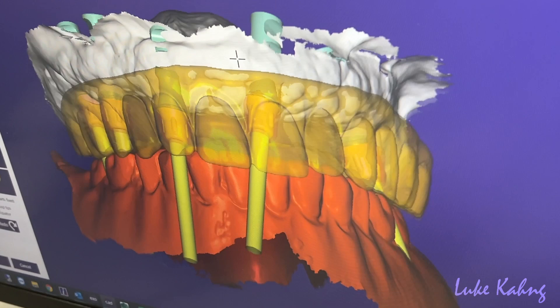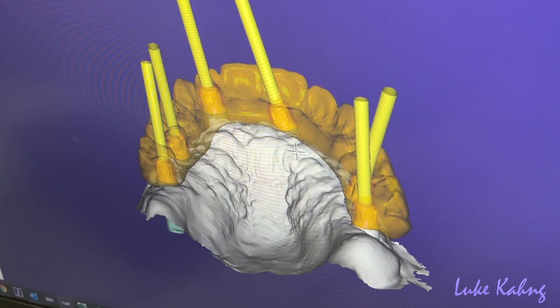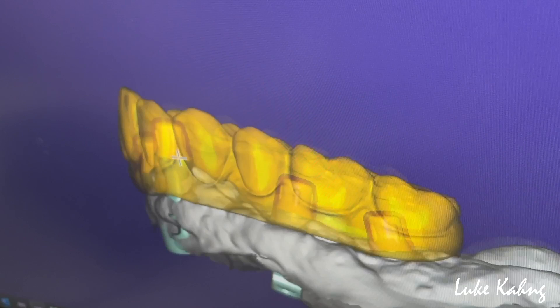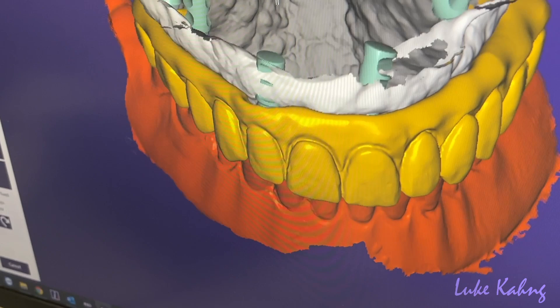Finally all together, which got us to where we could start the design with everything lined up. One thing we noticed — the implants are really tall and a bit out. The scan bodies look good overall; this one had an angled screw channel because it was originally pretty far out, but they got an angled multi-unit on it. We let the doctor know and got information about the aesthetics.